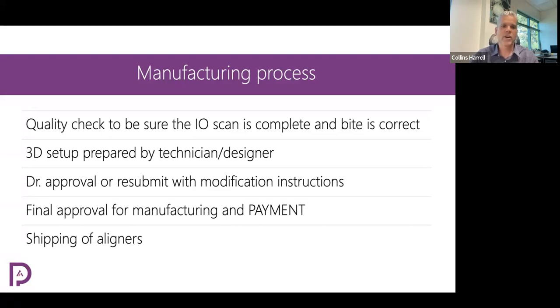Okay, and then we're going to evaluate the 3D setup that's been prepared by the technician or designer at the other end.